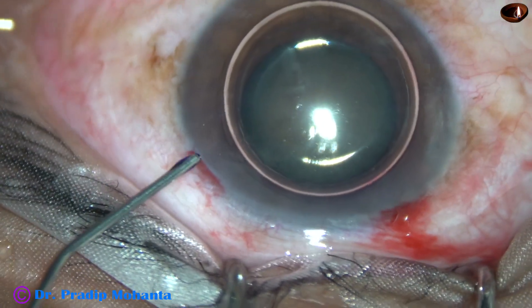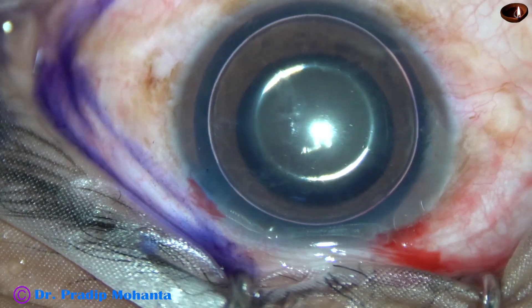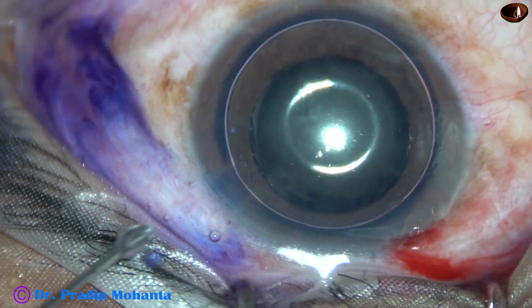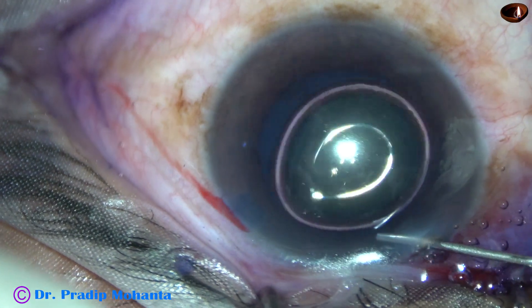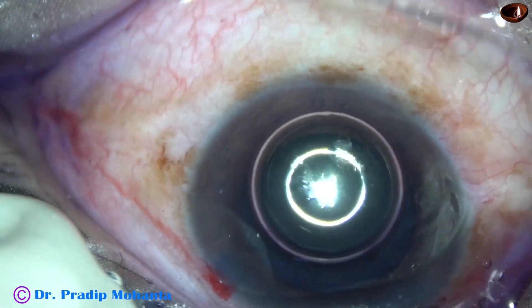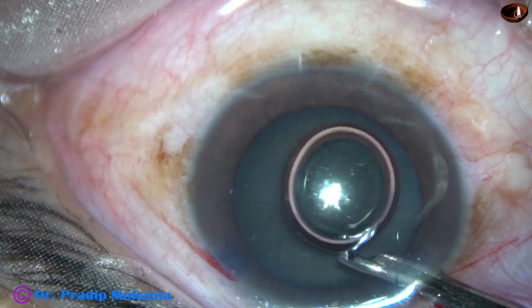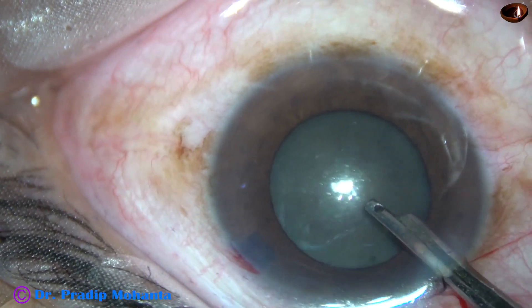The main incision and a side port on the left side of the main incision has been made. Trypan blue dye has been applied underneath an air bubble. And this is adrenaline to see if the pupil dilates a little more, but in this case the pupillary dilatation remained the same. However, whatever dilatation is there at present is okay.